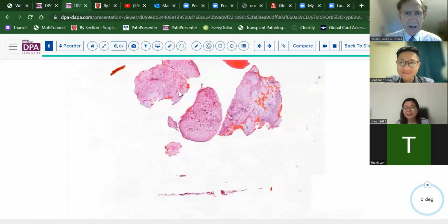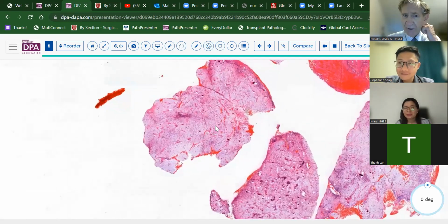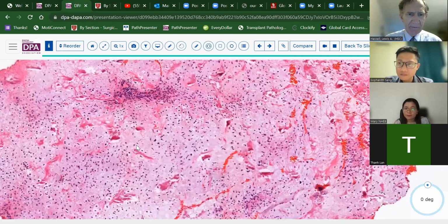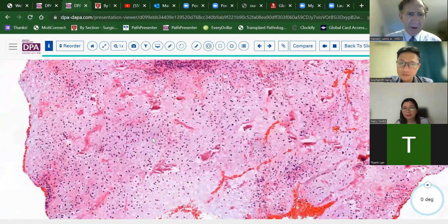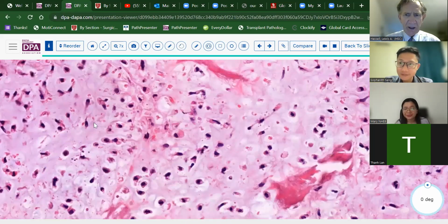Okay, well, this is a small biopsy from a young child with a somewhat lytic lesion in the bone, and needle fragments, curetting fragments were obtained. And you can see here that we have a little bit of a sort of myxoid appearance to some of this, not quite chondroidish, but maybe a little bit chondroid or myxoid, and somewhat stellate appearing cells.